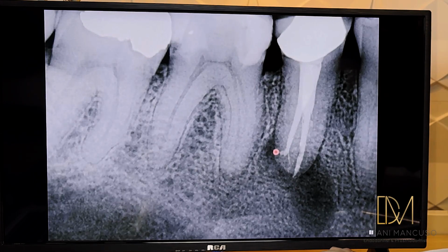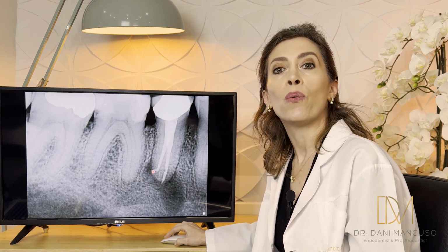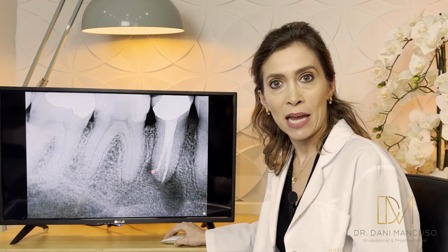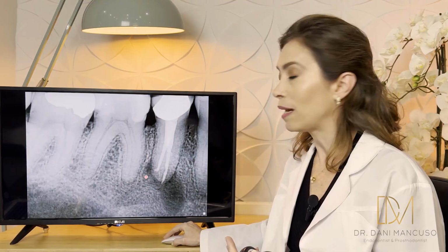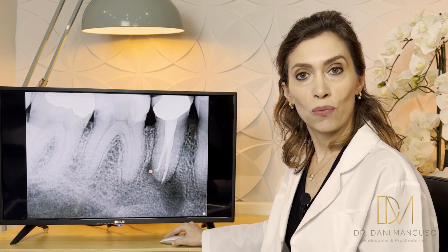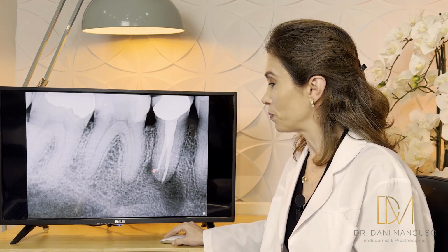Once you get to the length, all the files that you put inside will do up to a 10, of course, so 6, 8, and 10, will do at that point patency. Make sure you do patency. What is patency? Patency is when you have the working length plus 1. And the reason you do patency is because you don't want to block that part. So make sure that it's always unblocked.